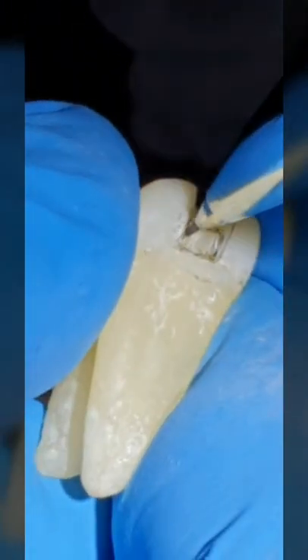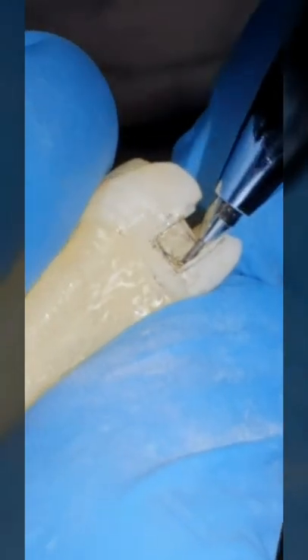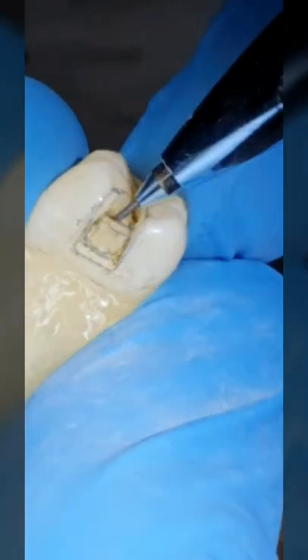And the retention bur angulation is not like this, but it goes sideways into the facial and sideways into the lingual aspect. So this is the retentive feature right there. The bur disappears into the dentin. Here also the bur disappears into the dentin, and that's where the retention comes in.